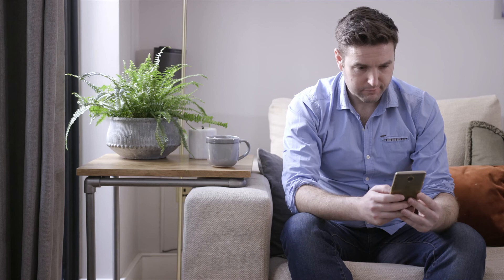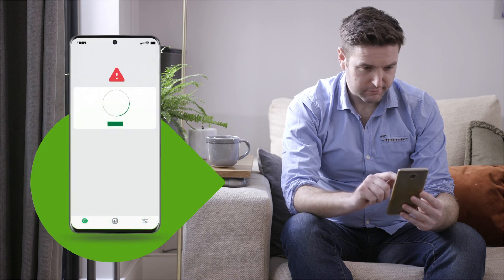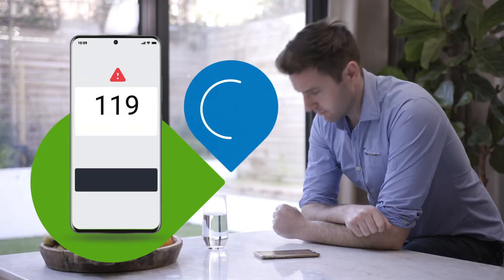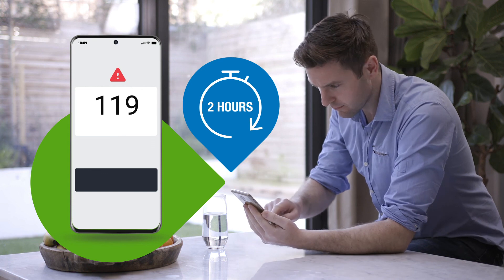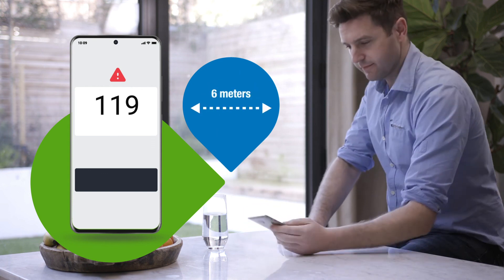Back on the app, confirm you have inserted your sensor and attached your transmitter. Wait for your transmitter to pair and start the sensor warm-up. The warm-up will take two hours to complete and you will not receive readings during this time. Keep your smartphone close to you, within six meters, during warm-up.